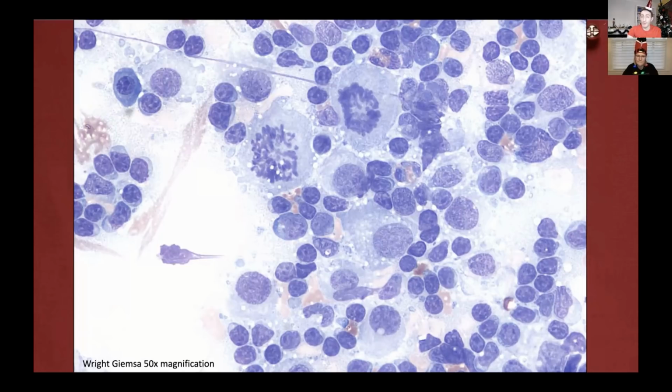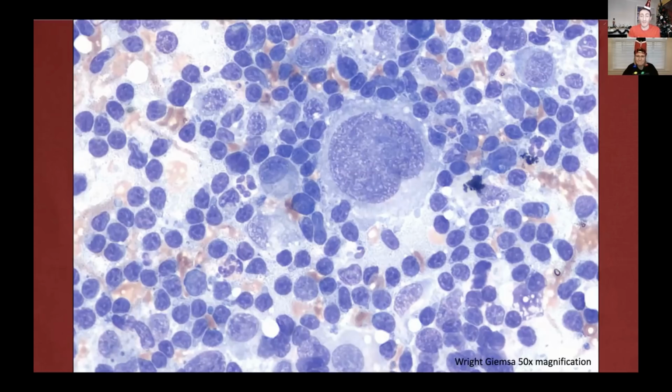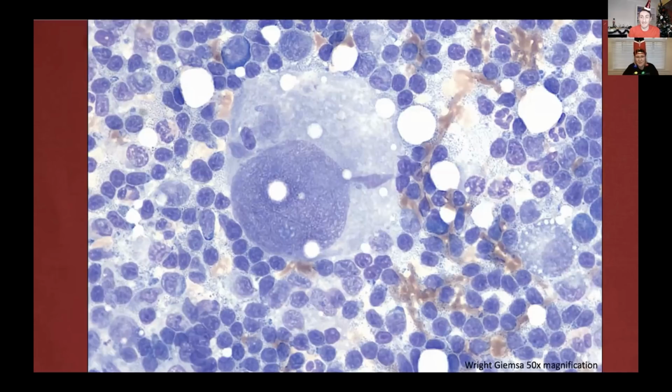Then by looking around at this case, I start seeing some, I would call them monsters, not very scientific, but they look like monsters, like this big one, this giant with this funny-shaped nucleus, and then even worse, something like that. Oh wow, that's quite big, isn't it? Those are the fun ones. Yes, exactly. You start going, what? Whoa. And then it's not good news, sadly. I was quite puzzled by this case because those cells were quite unexpected. Even if I had histiocytic, macrophagic morphology, they didn't convince me of traditional macrophages or histiocytes. What do you think? Do you have any idea?